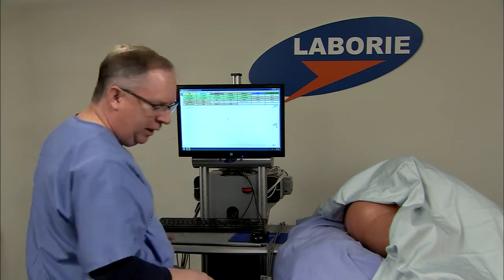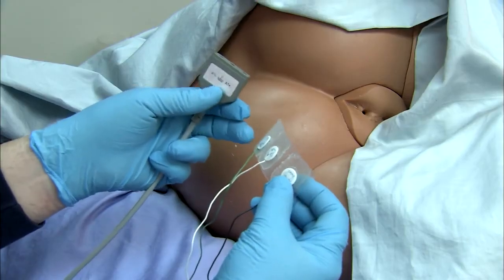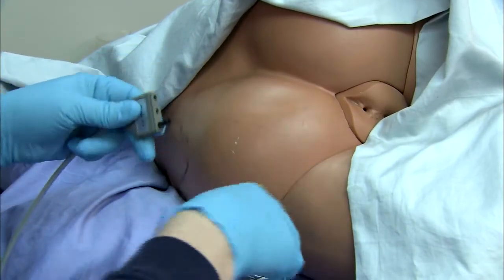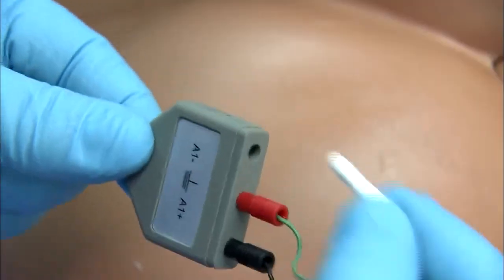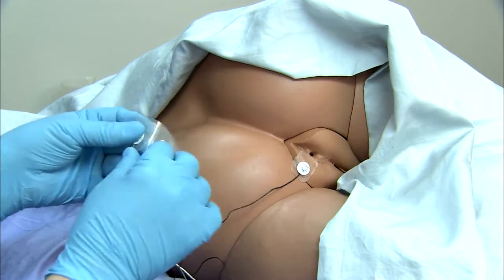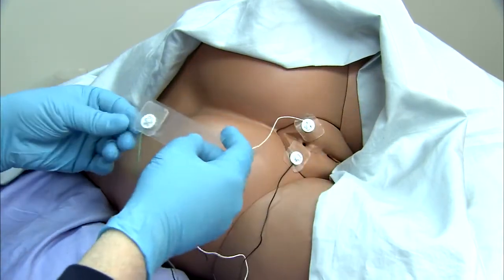Go ahead at this time and attach the EMG electrodes to the patient. Again, as any time you're doing EMG, make sure the skin is prepared well. The skin needs to be clean, dry, and intact. The EMG patches should be placed on opposite sides of the anus at 2 and 10 o'clock and should be as close to the anal verge as possible.